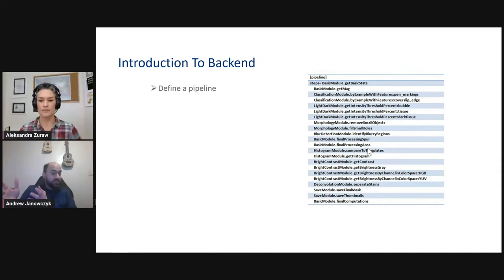So we added additional features, but everything else worked exactly as it was, because you're comparing now IHC values to other IHC values, right? You wouldn't compare an H&E set of metrics to an IHC set of metrics. And as a result of that, you really break it down on a piece by piece basis.